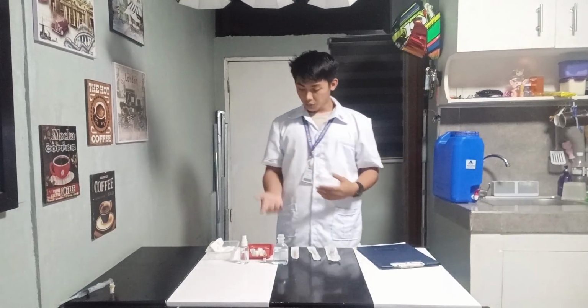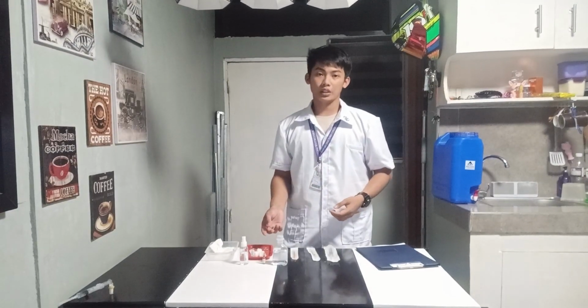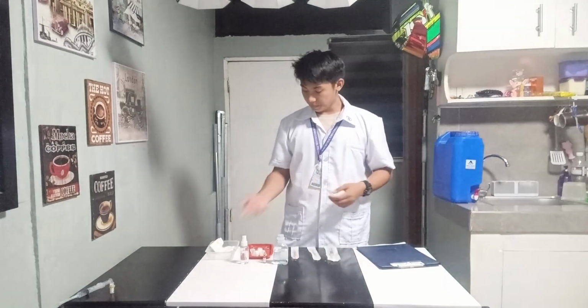Alcohol, and sterile water, which will serve as a medication. Cotton balls soaked in a 70% alcohol solution, and I have waste receptacles. This is where I will dispose the used needles and syringes so as to avoid needle prick injuries.